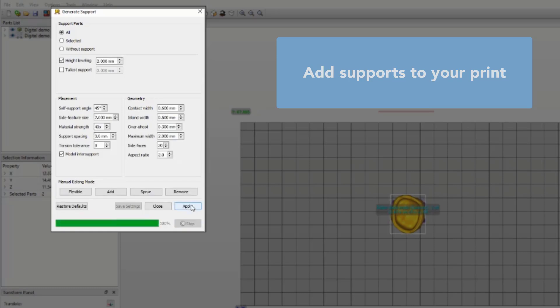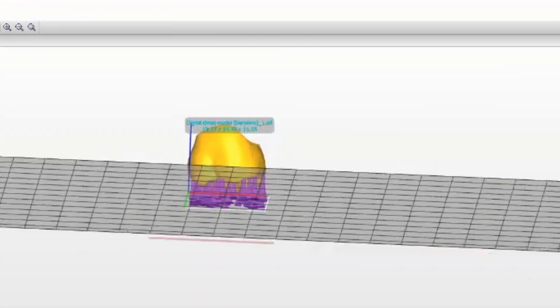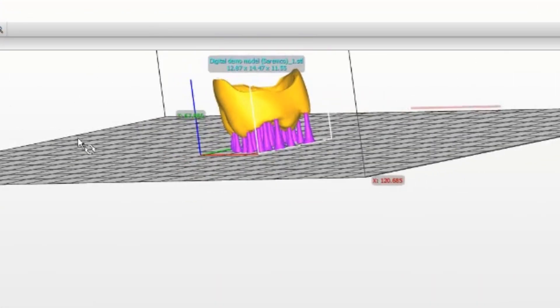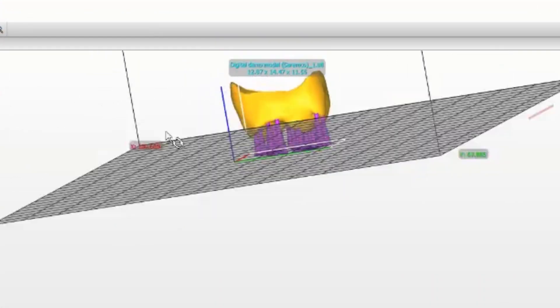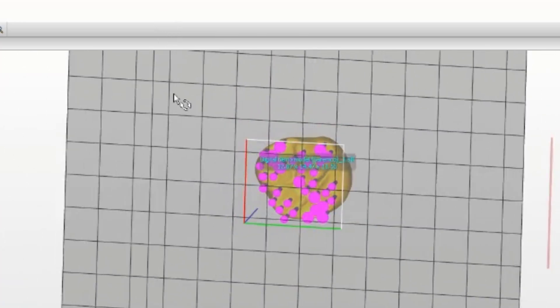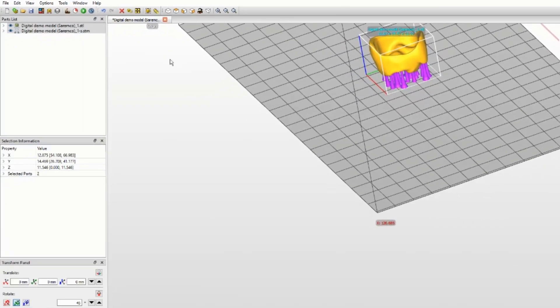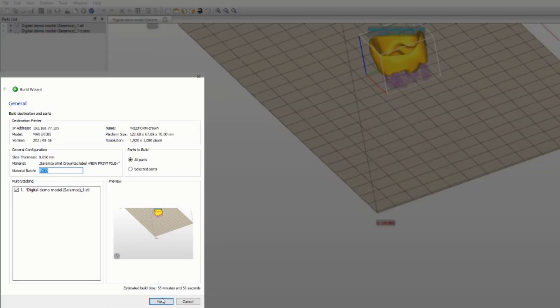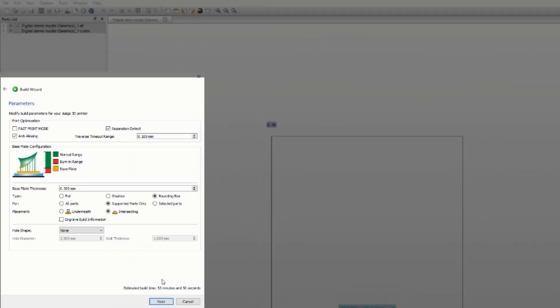Make sure not having too many supports as it could change the surface and it can be hard to be removed. On the other hand, not having enough supports can cause print failure.